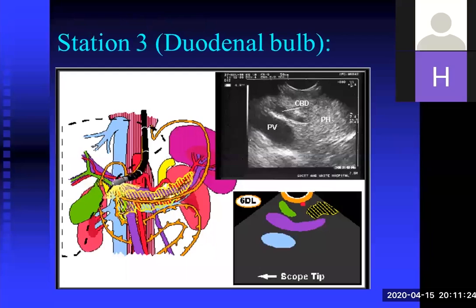Then let us withdraw the echo endoscope more and more up to locate in the duodenal bulb. We locate the echo endoscope in the duodenal bulb with a slight push to impact the tip of the echo endoscope at the duodenal apex, which is the roof of the first part of the duodenum, but move very gently, because here we may induce perforation if the movement is strong or violent. So we should move with the echo endoscope very gently in the duodenal bulb, especially.